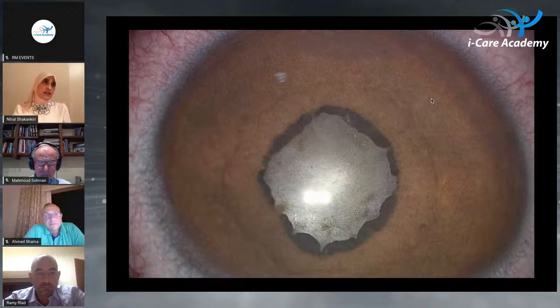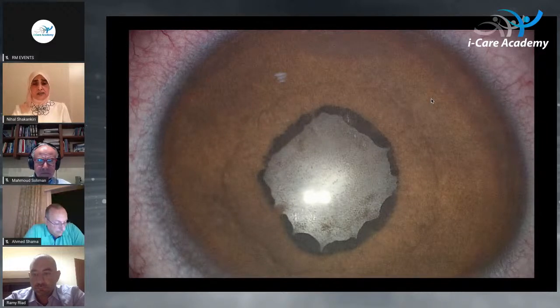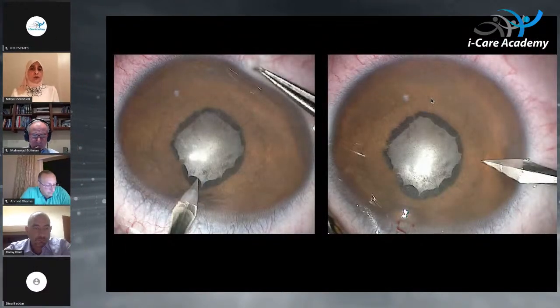In cases of JIA, as I told you, in bilateral cases, we prefer to go to surgery without IOL implantation. And I prefer to go through a corneal approach. I don't like to go posteriorly. You want to preserve the sclera and the conjunctiva. I don't want to go for fibrosis because you may need the conjunctiva to be healthy, maybe for future trabeculectomies in these cases.